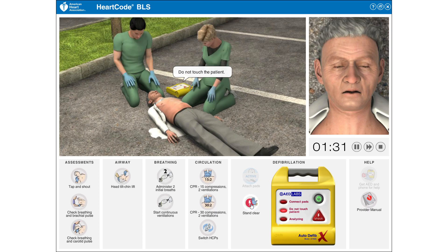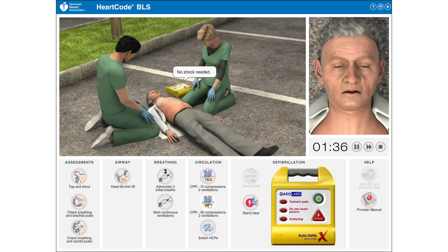Do not touch the patient. Analyzing heart rhythm. No shock needed.